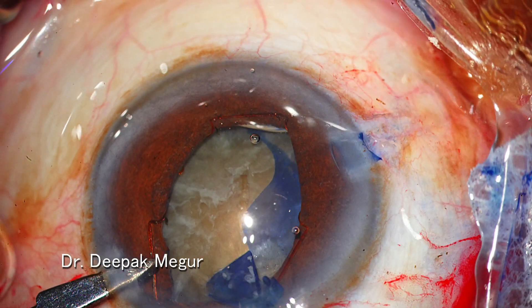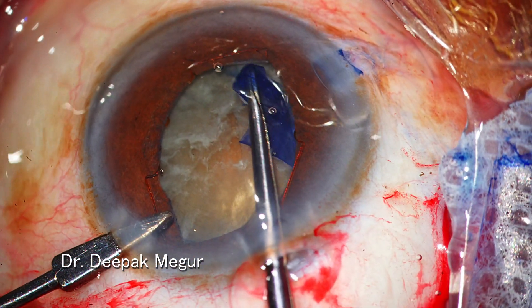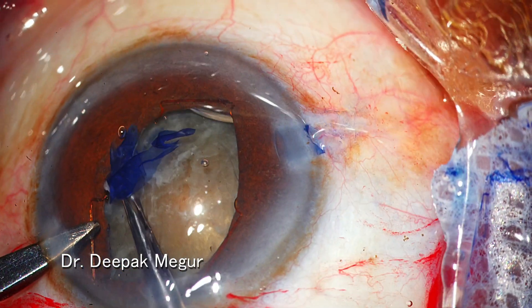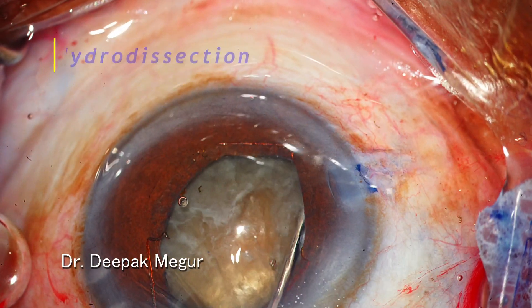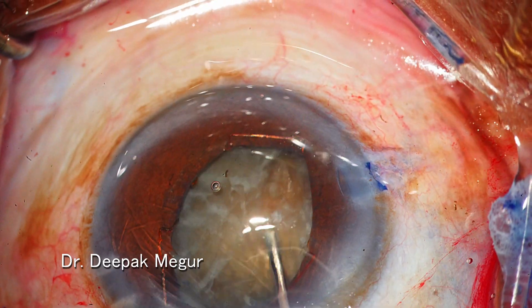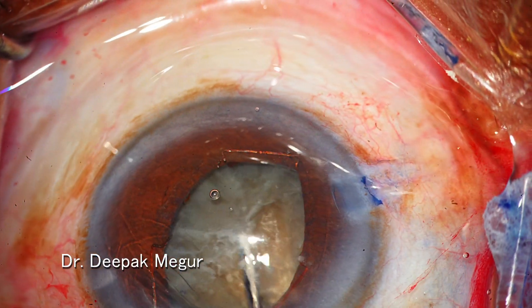I'm trying to make a bigger rhexis and I'm able to do it quite easily, because in a hard nuclear cataract these cataracts offer a perfect base to perform the rhexis of a desirable size. Now hydrodissection is performed and I just nudged the nucleus — it's confirmed that the nucleus is free from all capsular attachments.